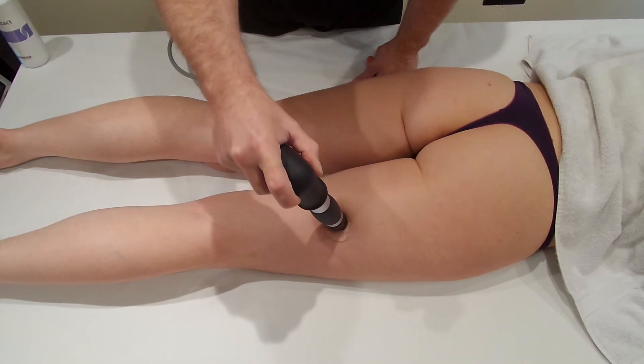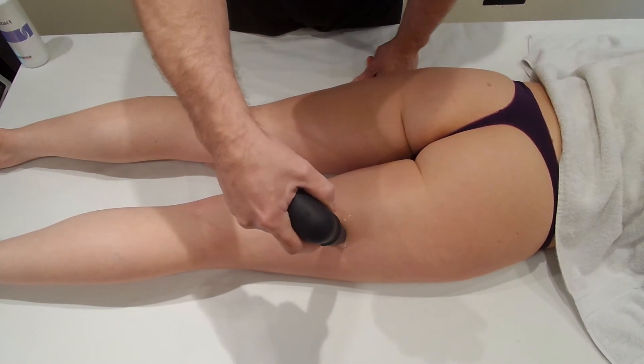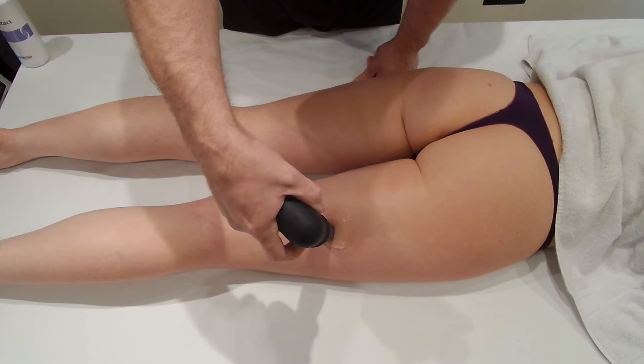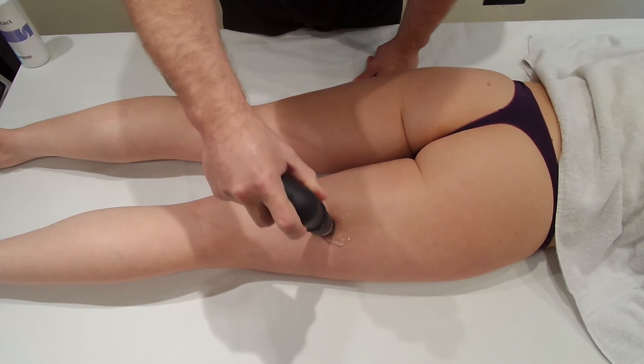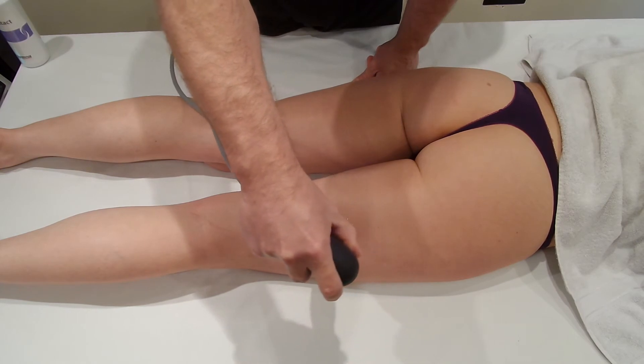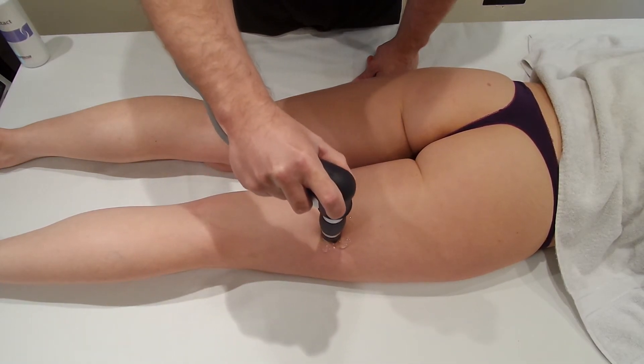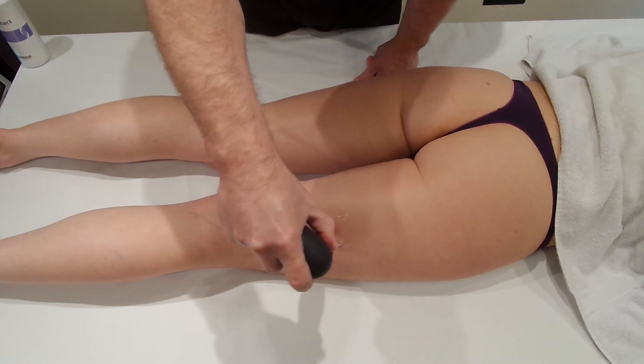Some people stop every 200 shocks and move, and do a different area. Some people just keep the shockwave machine going and roughly every 200 shocks then move on to a slightly different area, a slightly different trigger point. It depends how close the trigger points are together.